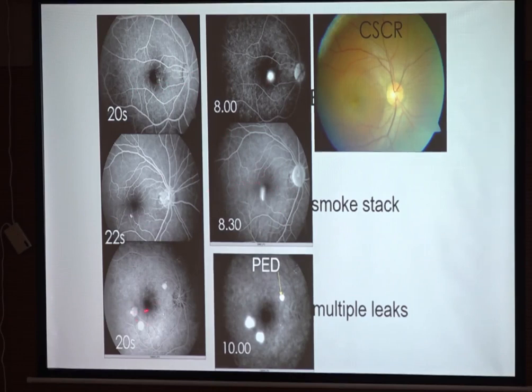And this is again a very classic example where you're seeing increase in hyperfluorescence. Here on top, it's just increasing in intensity. The size is not increasing. So this is pigment epithelial detachment. And lower down, you are seeing one small dot which is increasing in size as well as intensity. So this is leakage and suggestive of ink blot pattern. And the one lower down is again leakage.